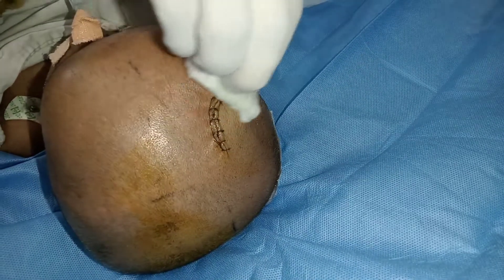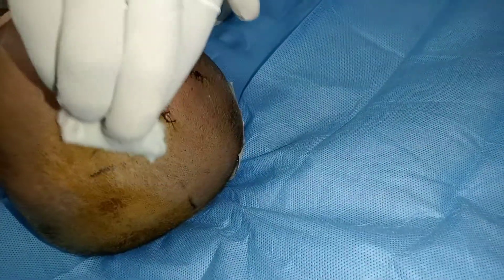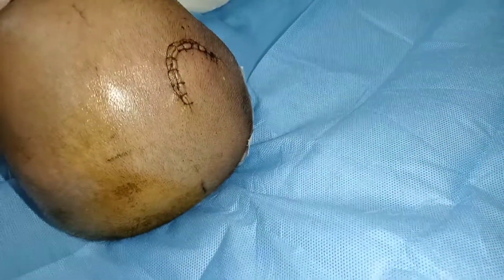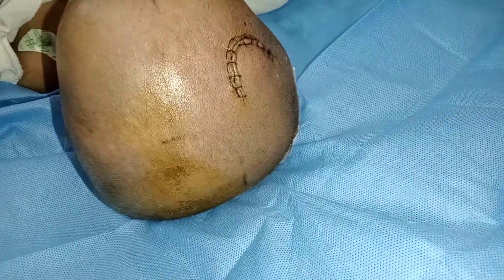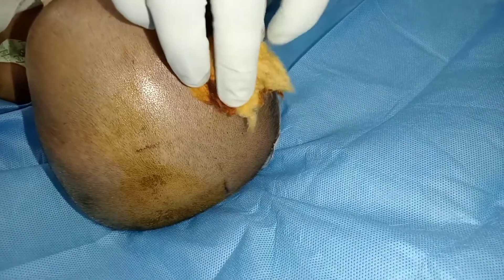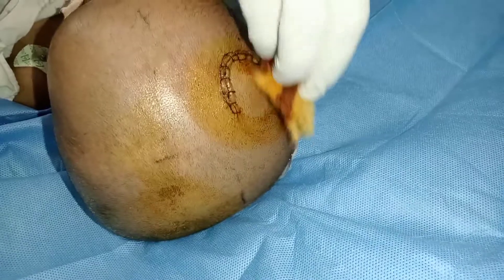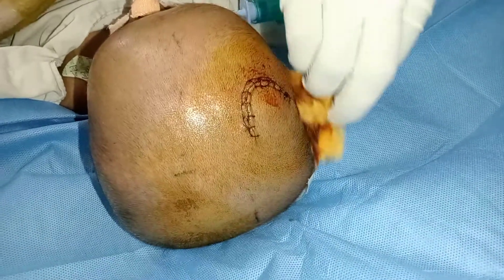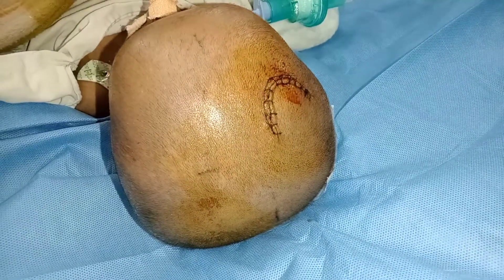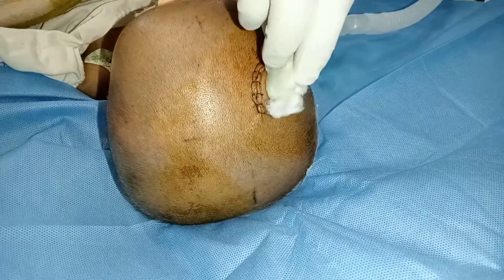We start the procedure under strict aseptic conditions by wearing sterile gloves and cleaning the area with spirit or sterilium. After that, we clean the area with betadine-soaked cotton or gauze piece. As per the standard dressing and draping procedure, it is a three-step process: first sterilium or spirit, then betadine, and again sterilium or spirit.